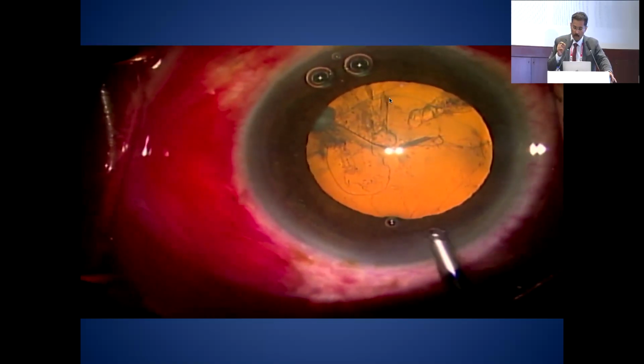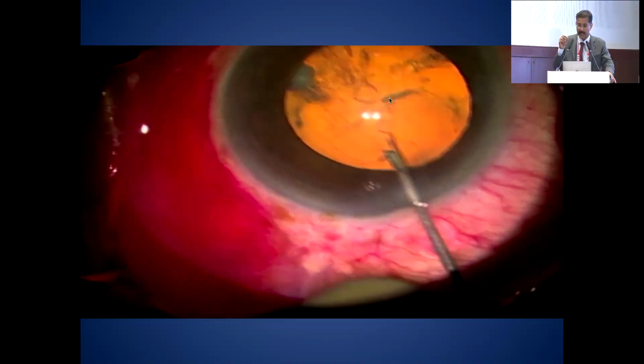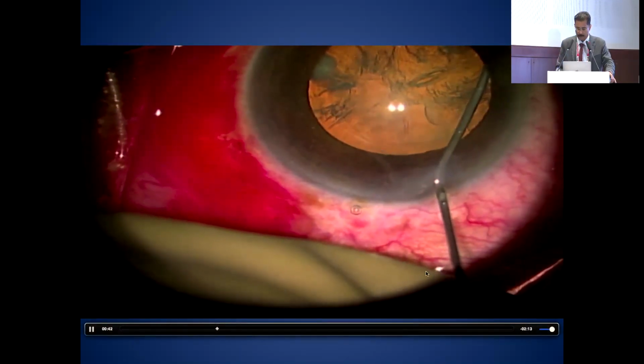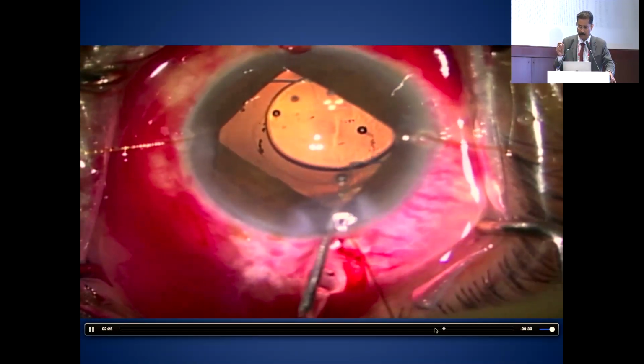And if it is too loose, you will see while puncturing itself it is difficult. You will see folds radiating from the puncture. So that again shows the zonules are weak in the periphery. So use very sharp instruments and microrhexis forceps if you need to, and complete your rhexis. And without a rhexis, it is very, very difficult to place these kinds of stabilizing devices.